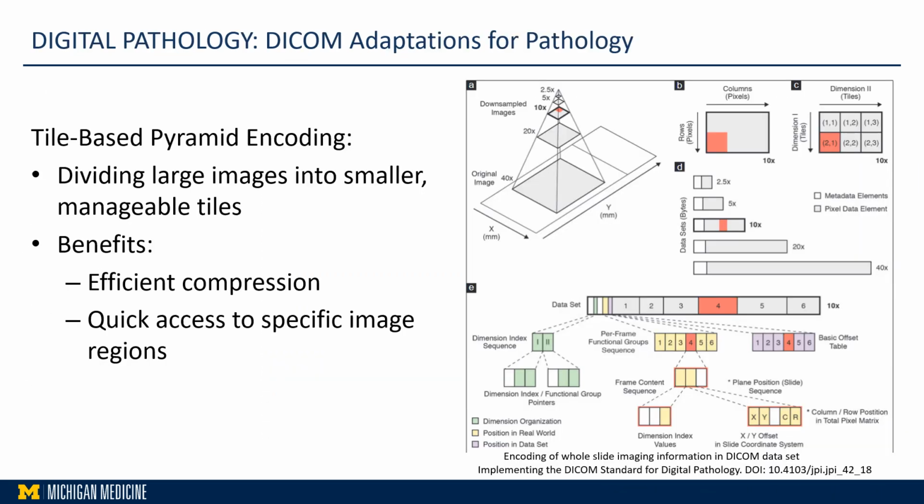And in pathology right now, we've been fortunate to have supplements already implemented within the DICOM standard. Those are the supplements called tile-based pyramid encoding, which technically divides the large image, which is the whole slide image, which as you know is pyramid shaped in format, into smaller manageable tiles, and each tile has efficient compression and quick access.